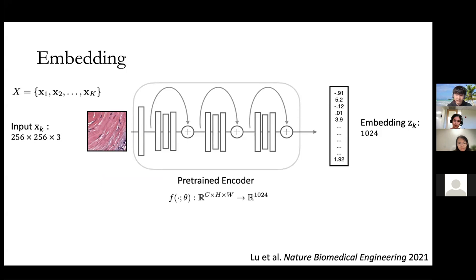And then the second step, we're able to do supervised learning directly on the entire histology image in the low dimensional embedding space. So as to how we actually perform the embedding, initially we thought we needed to do some kind of self-supervised learning to learn a good low dimensional representation of our images. My first work was actually a workshop paper that did this using, at the time, contrastive learning, one of the earliest methods for self-supervised learning based on contrastive learning.